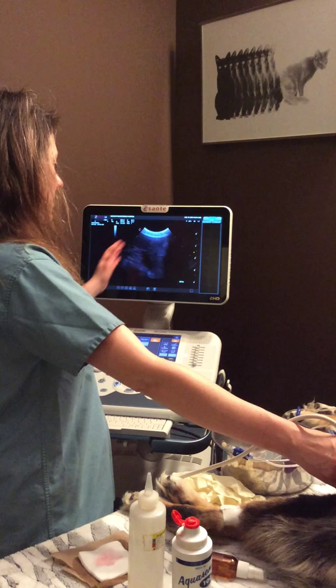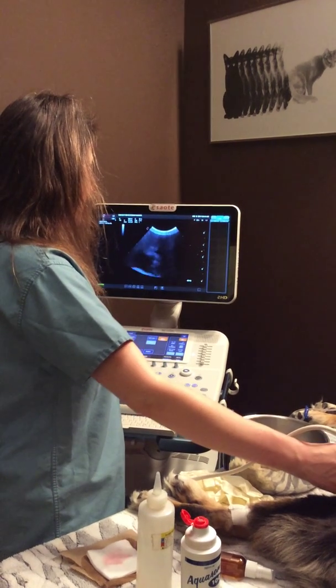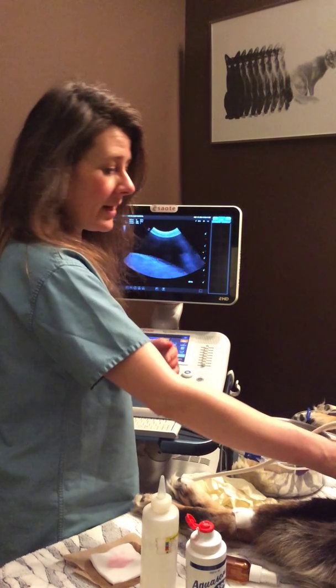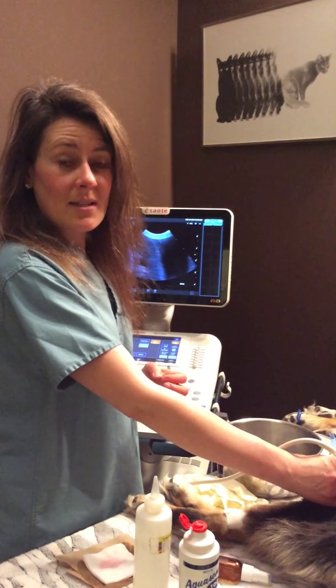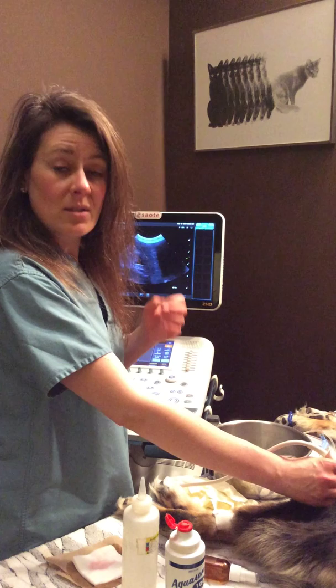I just wanted to show you the screen and some of the fluid that is in her belly that we're going to remove today. We do ultrasound a lot — it's very good for diagnostics, as well as monitoring and treatment progress.